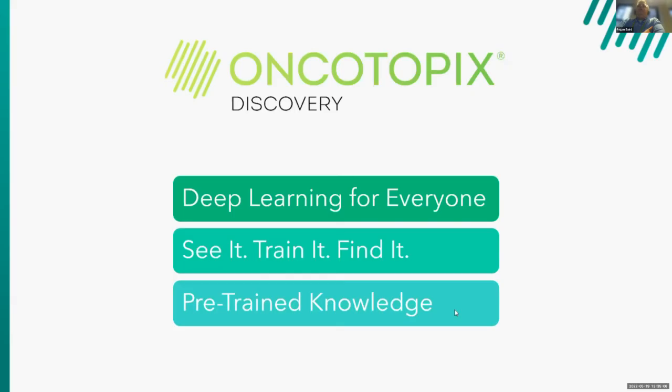And the technology that we really want to leverage in order to make image analysis and getting data out of these digital images very easy is a technique called deep learning. I'm sure a lot of you have heard about AI and deep learning in the field. What we're trying to do at Visiopharm is democratize this technology, so anybody that has domain expertise in their tissue can use deep learning, because if you can see the objects in your image, you could train the computer to find them. And once the computer's found them, you can do a lot of quantitation and convert your images into graphs, because one image is pretty, but many images make a graph.